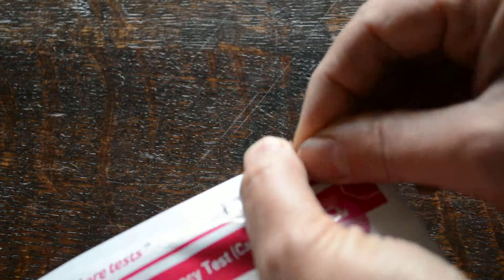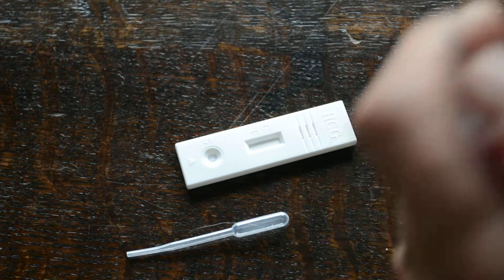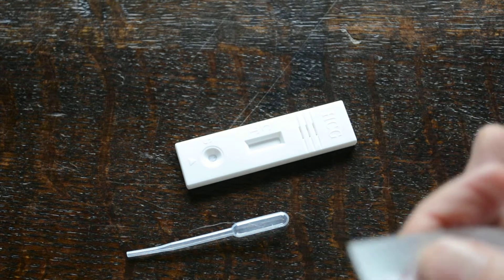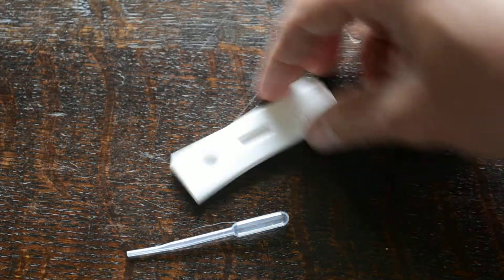So here we're going to run the test for you. Open the foil and remove the test cassette and pipette. Also in here you have a sachet of desiccant which is silica crystals to keep the test cassette in optimum form. That desiccant pouch is just there to keep the test dry and in peak condition for testing.